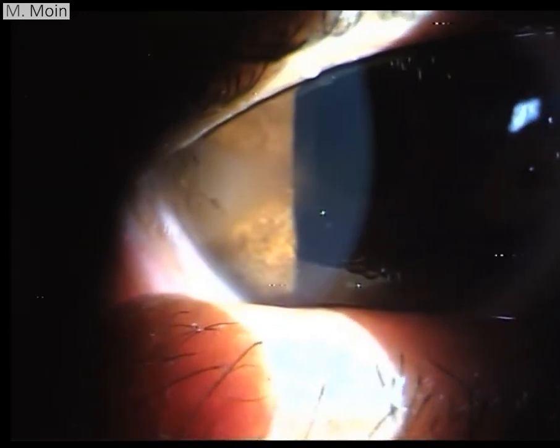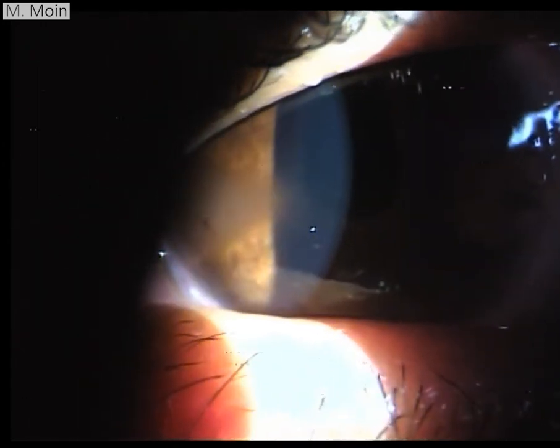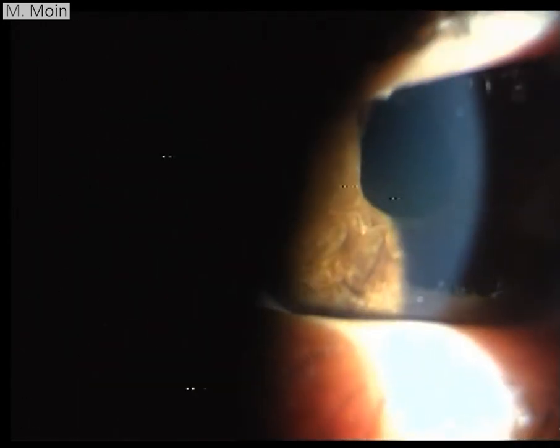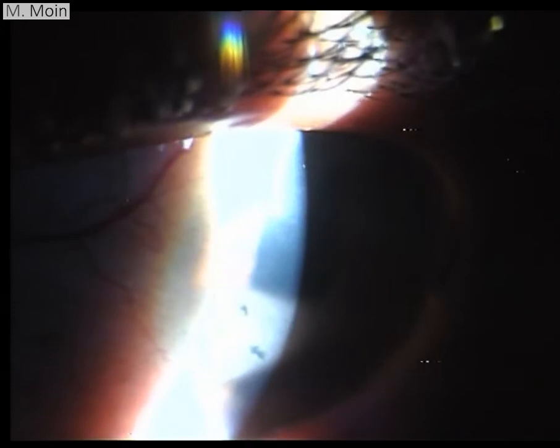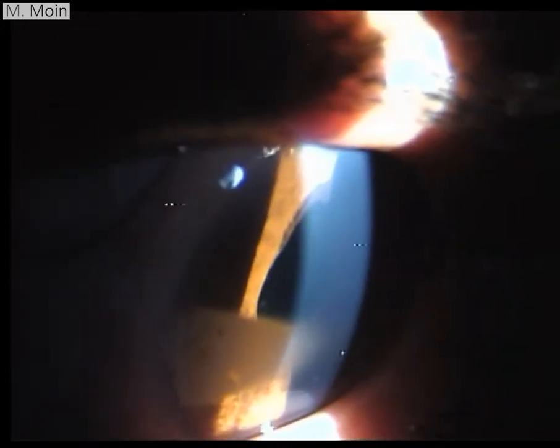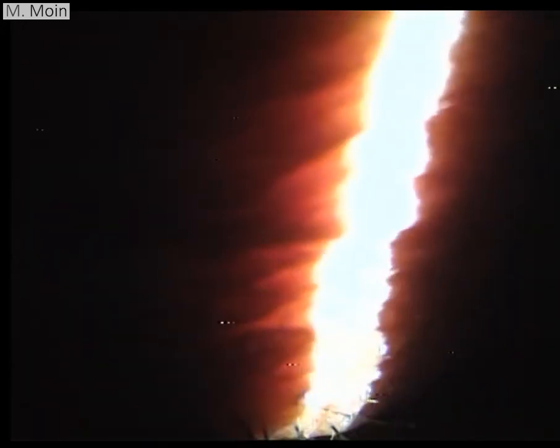The other thing which you want to do is then make a slit beam and then actually judge how thick or how thin the cornea is. So this patient was pseudophakic as well in this. So this is the area of band keratopathy which I'm highlighting, by asking the patient to look over to the temporal side.